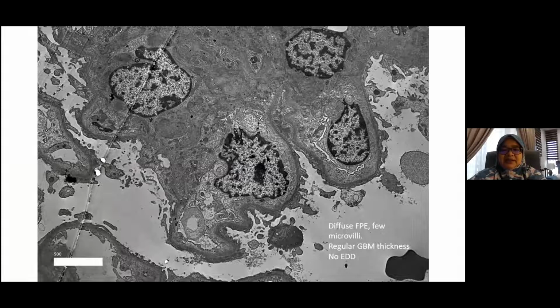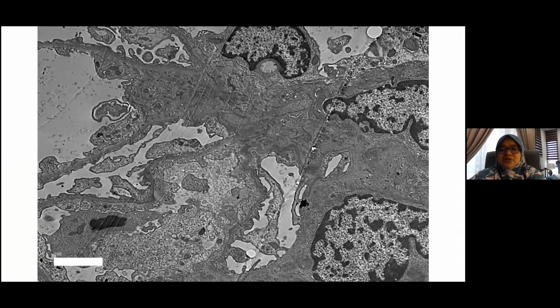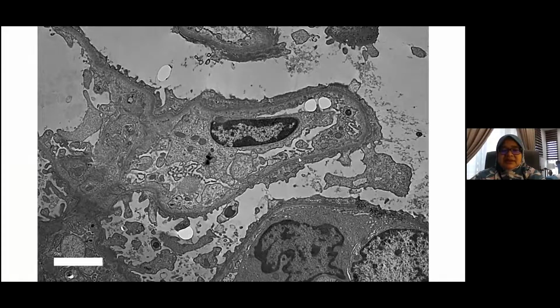And here there's quite diffuse foot process effacement, otherwise quite regular basement membrane thickness, slightly swollen podocytes. No electron dense deposits that we can see. No deposits within the capillary loops, along the basement membrane, sorry.